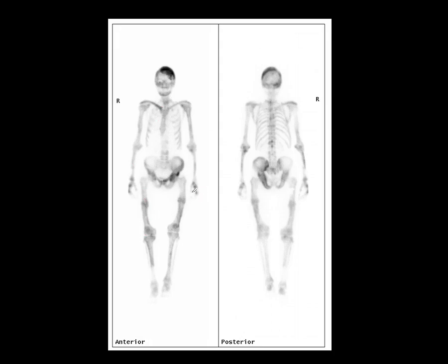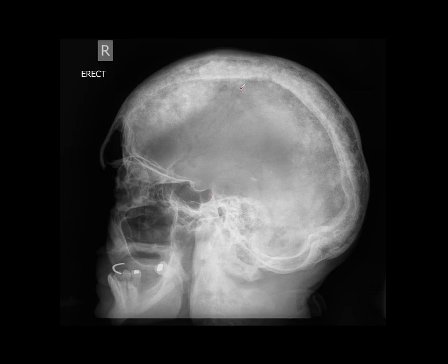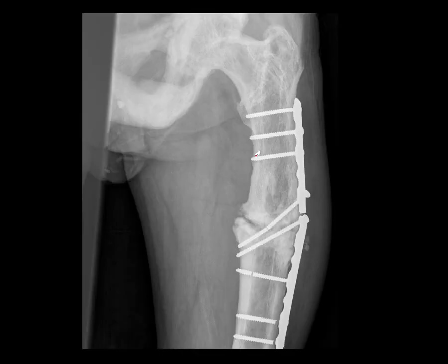Looking at plain x-rays of this patient: the skull demonstrates widening of the diploic space, classic of Paget's disease. In the femur, there is extensive cortical thickening, diffuse thickening of the cortex, and thickening of the trabeculae. The patient has sustained a pathological fracture due to chronic bowing of the femur, which has been fixed — though we can see some metalwork fracture. These are all classic appearances of Paget's disease.